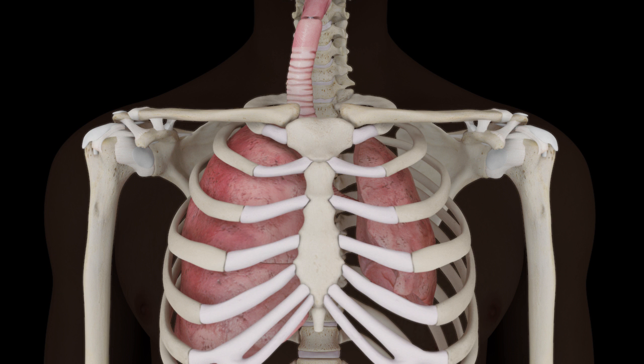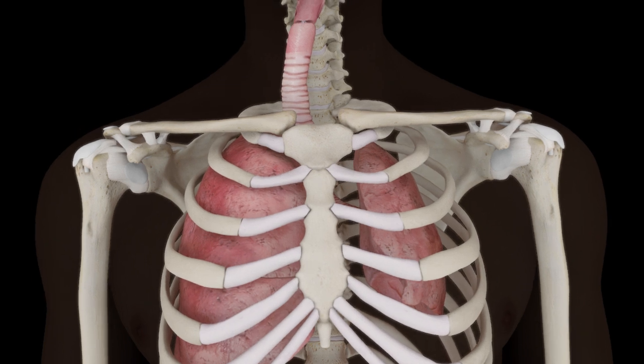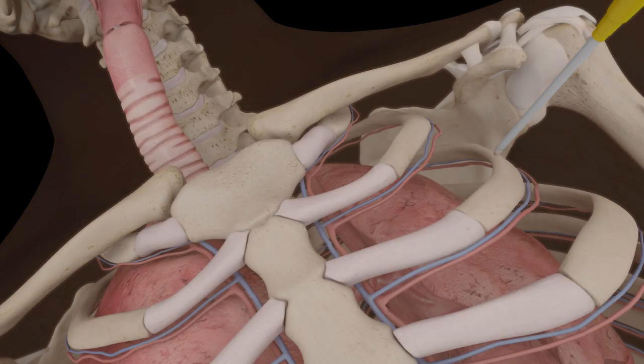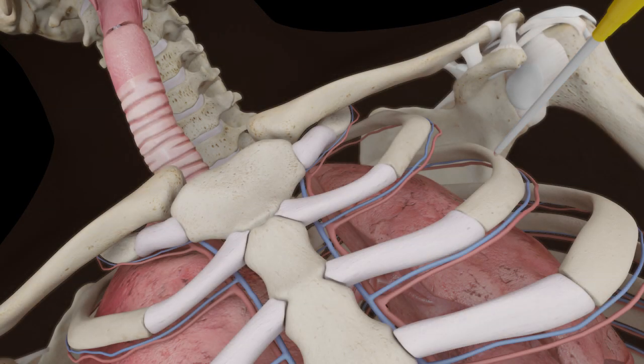Immediate treatment of a tension pneumothorax is done by relieving the increased pressure in the chest by creating an opening in the chest wall to allow the air under pressure to escape. This is done by inserting a needle catheter into the chest cavity. The technique of needle insertion is important to reduce the chance of injury to the lung or chest structures and ensure that the needle is in the right place to relieve the pressure.